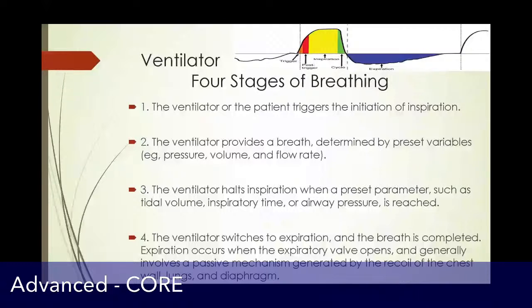So what does the ventilator actually do? It simulates breathing, and the 4 stages of breathing that we normally experience when we're not intubated are a little different when you're on a ventilator. The first step is that something triggers the ventilator to give you a breath.